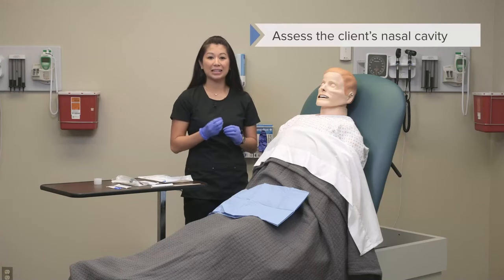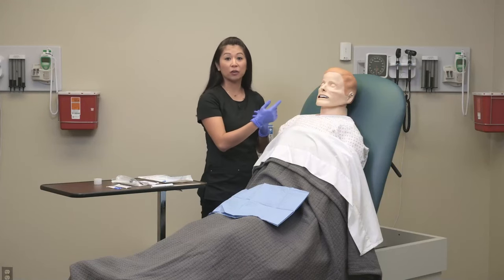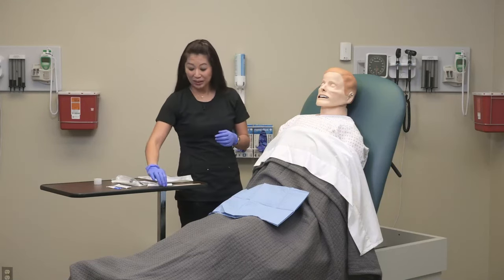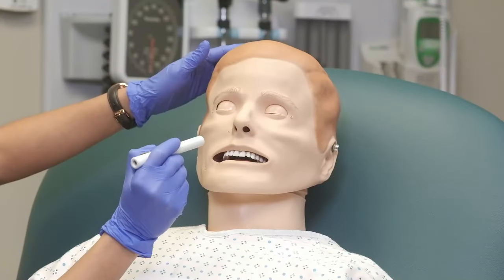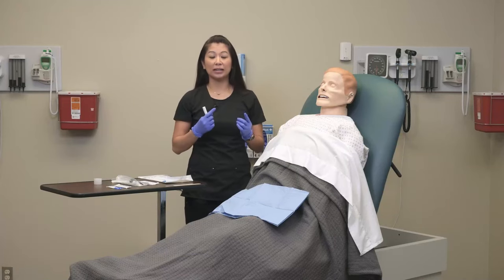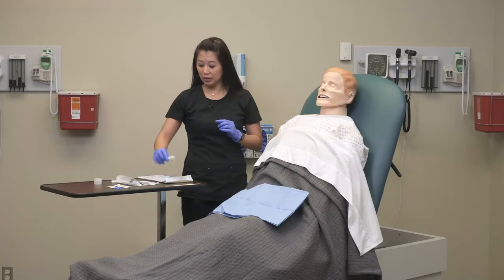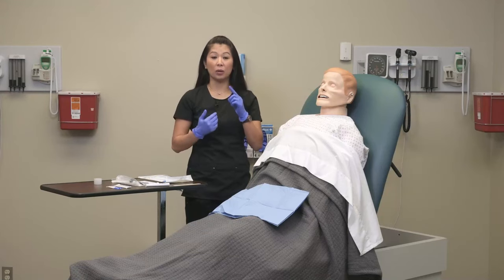Let's go ahead and assess the client's nasal cavity. I'm going to look at each nare. You can take a pin light and look up there, ask the patient if they have a deviated septum or any issue on one side or the other. You can also have the patient close one nostril and blow to see which one has a stronger airflow.